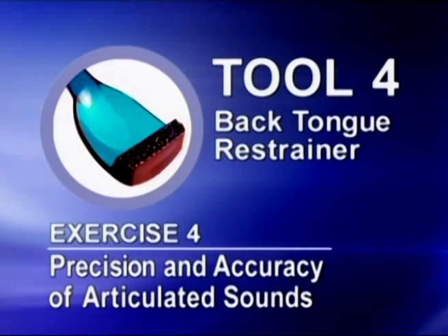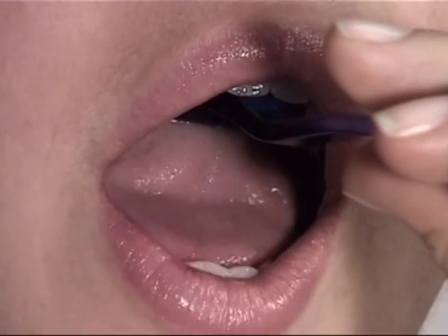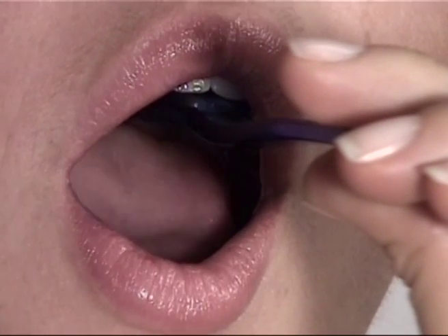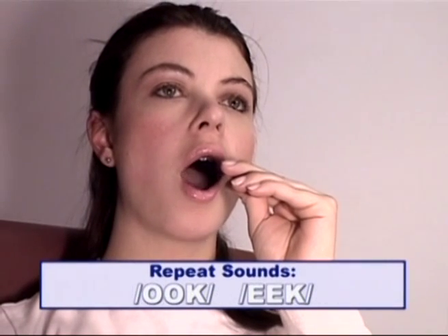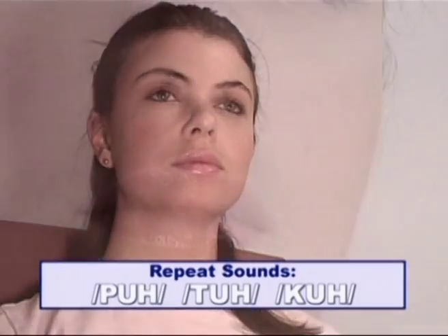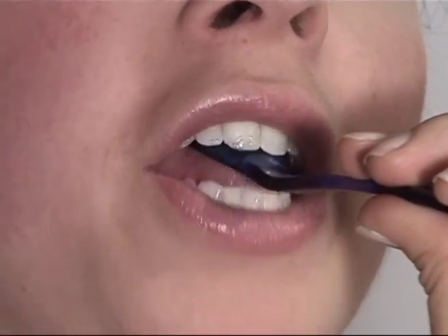The goal of exercise protocol 4 is precision of movement. Place tool number 4 on the palate behind the front teeth. Make sure that the back of the tongue makes contact with the ridge as the patient repeats the following sounds. Ka, ka, ache, ook, eek. Repeat the combination of sounds. Pa, ta, ka, pataka. Record the number of combinations articulated in 10 seconds.